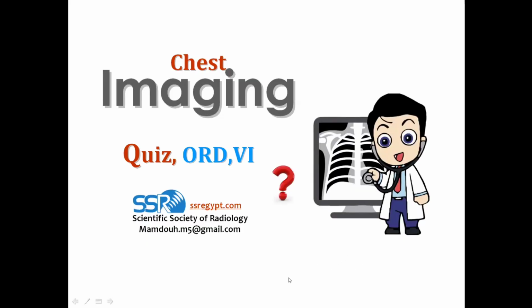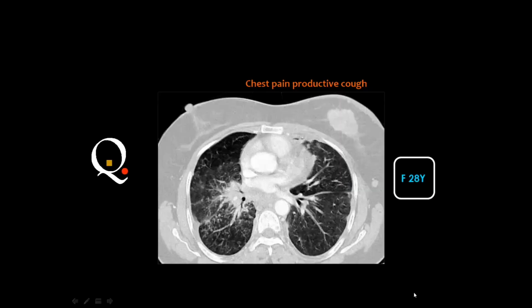And this is the first case. A female patient, 28 years old, presenting with chest pain and productive cough. And this is her CT scan.